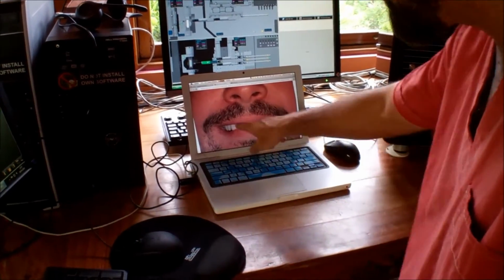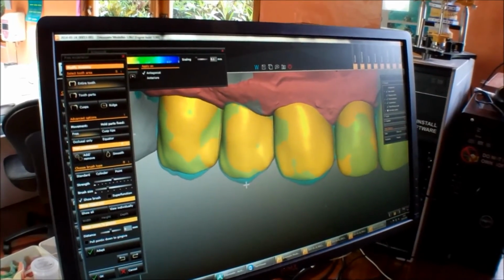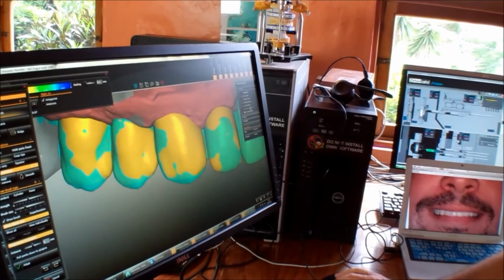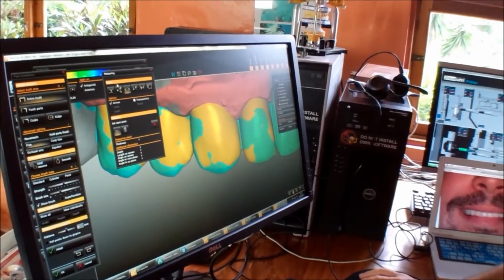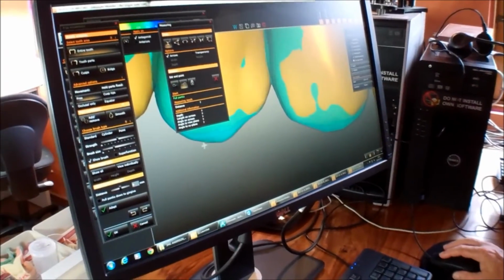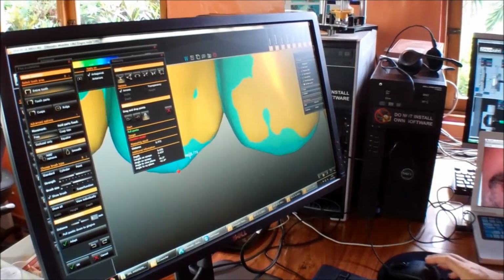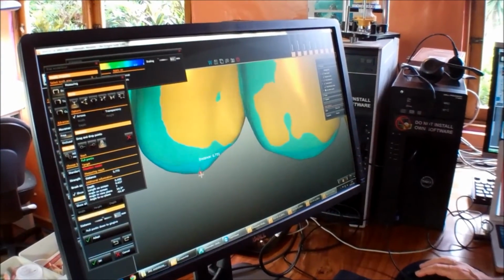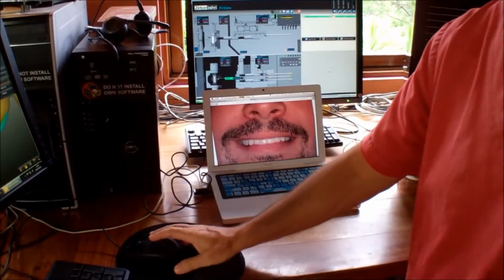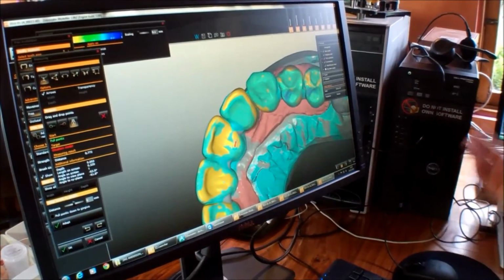So what we did, see this one? I made this one a little bit shorter. This is the difference between how it was and how it is now. Okay. I don't know, we can measure it. Let me see if I can do this. 0.772. Oh, wow. It's not 1 millimeter, less than 1 millimeter. Just the difference. And 1 millimeter is exactly the shape of the point. Right. So I already did this change, this one and this one. Then I did this one, and everything's okay. So I'm already milling it.